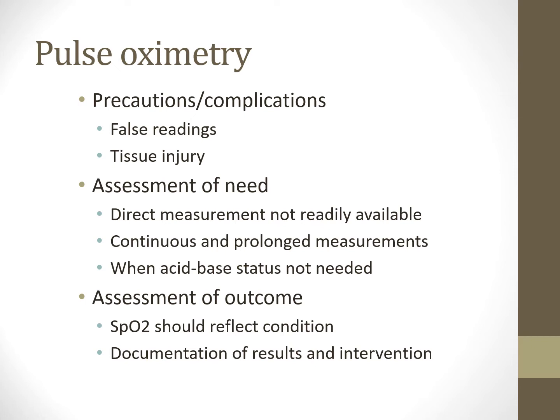The pediatric ICU is a very classic case of this. It's rare that we put art lines in kids as well. So usually they'll have a central line, and so we'll draw blood gas for pH and CO2 off of the central line. So we'll draw VBGs if needed. But with kids, especially, they don't usually have any vascular issues. If they don't have any vascular issues, I should say, which is rare if they do. But if they don't, then they should have good perfusion, therefore a good correlation with oxygen monitoring here.